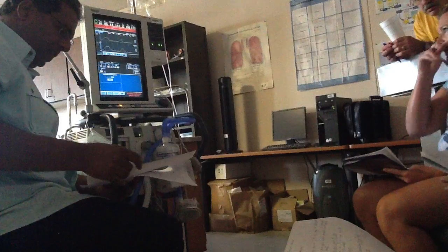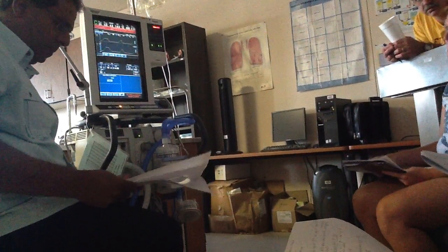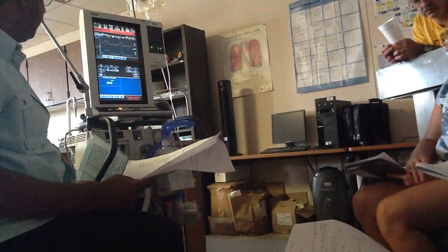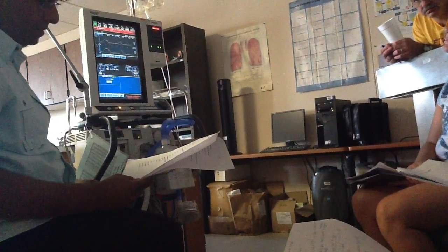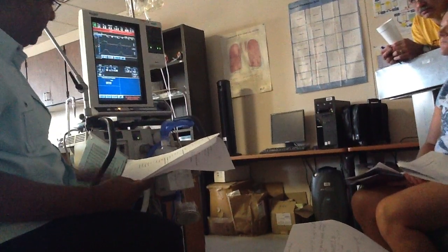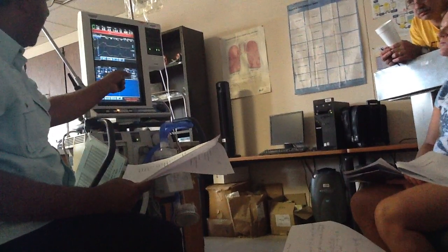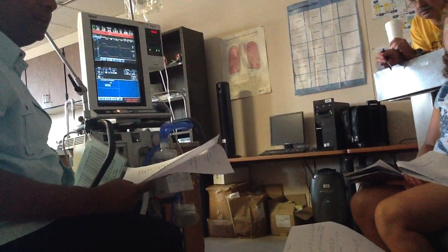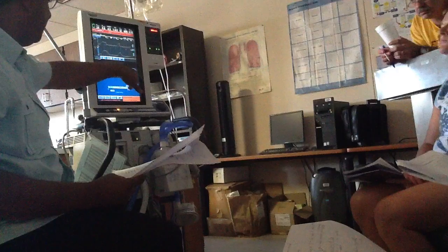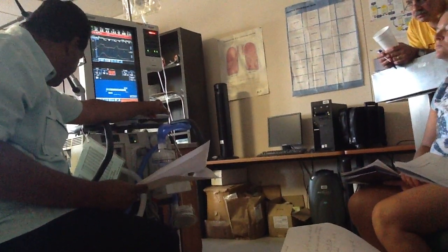You need to fix the ventilation and fix the oxygenation. So what would you do? Increase the PI. We can't on this machine unless it goes so high on our patient. So you would increase the PI to 30 and increase the respiratory rate to 14. And you change the IE ratio to 1 to 1. How do you do that? You unlock it, dial it to 1 to 1, and then you lock it.